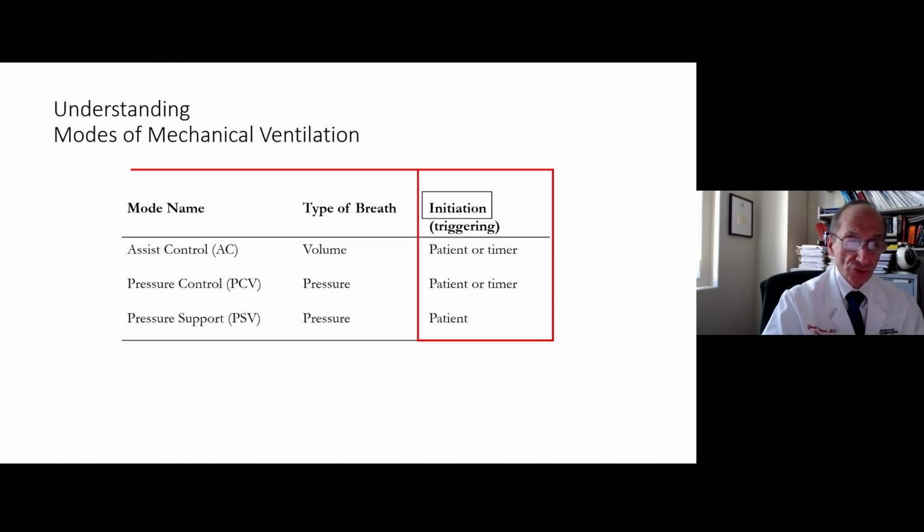For pressure control ventilation, it's the patient or a timer as well that will trigger the inspiration. Pressure support is different. That's a spontaneous mode, and only the patient can initiate or trigger a breath in pressure support.